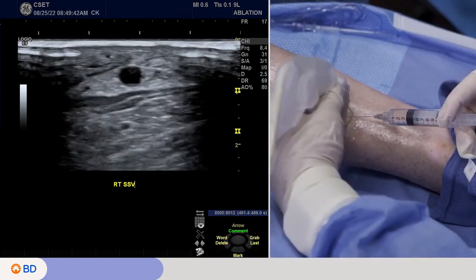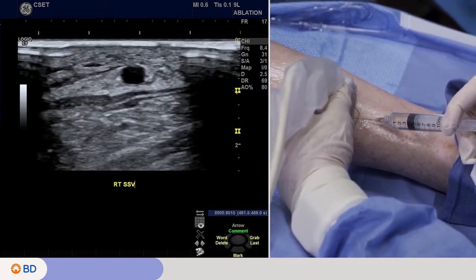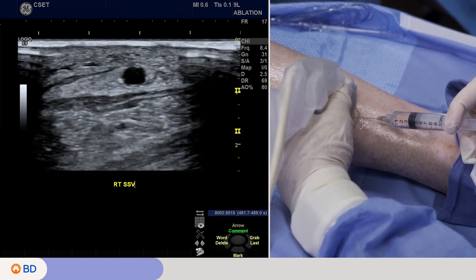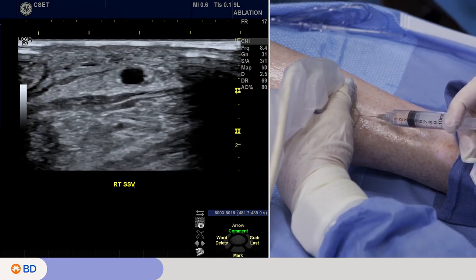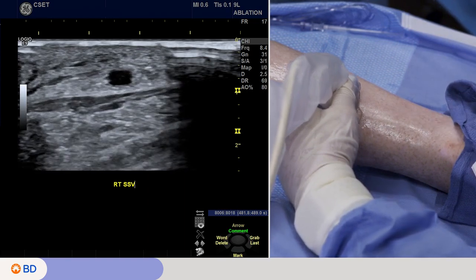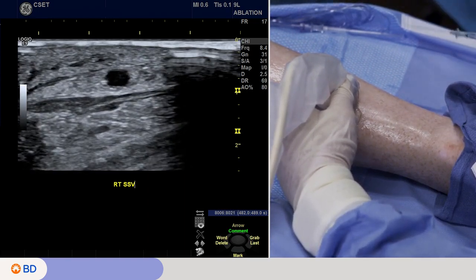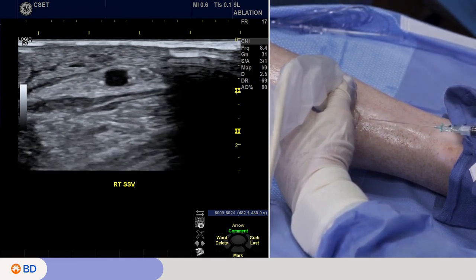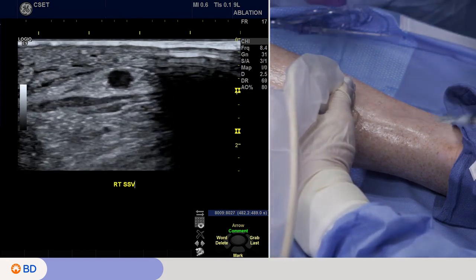And so I'm going to give a little bit of a wheal here. It's hard to see with the gel. You want to be careful when you're numbing the leg that you don't induce spasm right at the spot where you want to enter. You can see I'm going pretty slow so that I don't go too deep and get into the vein itself. These veins are very vasoreactive, and so you can induce spasm quite readily.